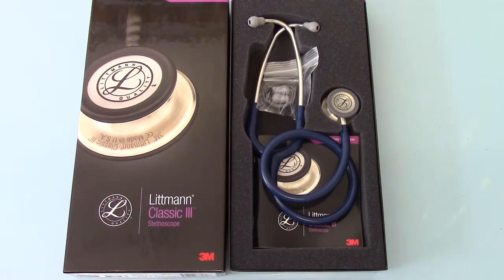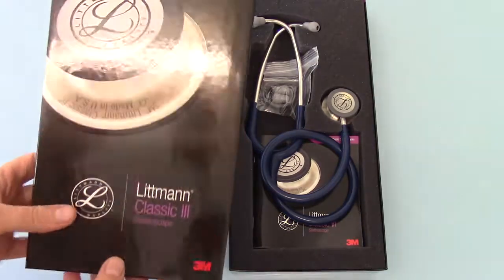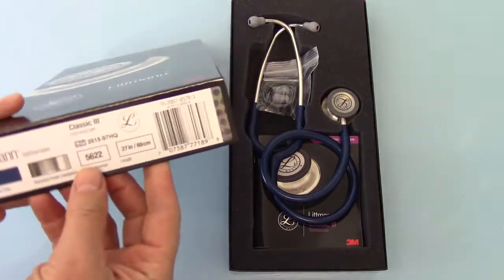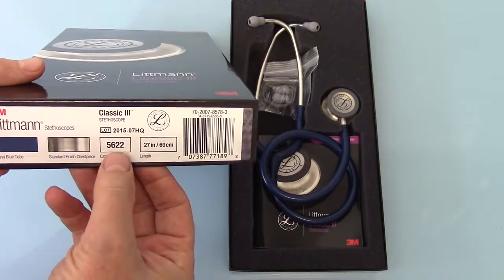Welcome to this product demonstration of the Littmann Classic 3 Stethoscope by 3M. We're showing you the model here in the navy blue. This is the standard pack outer from Littmann. The catalogue reference code for this colour is 5622.